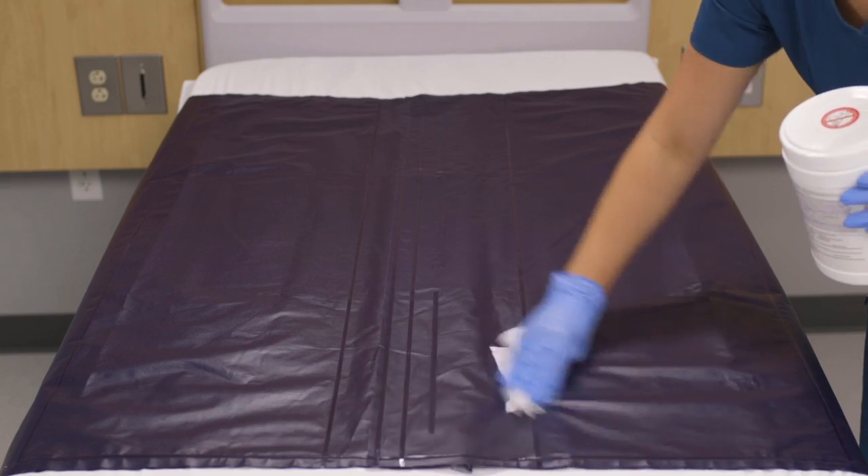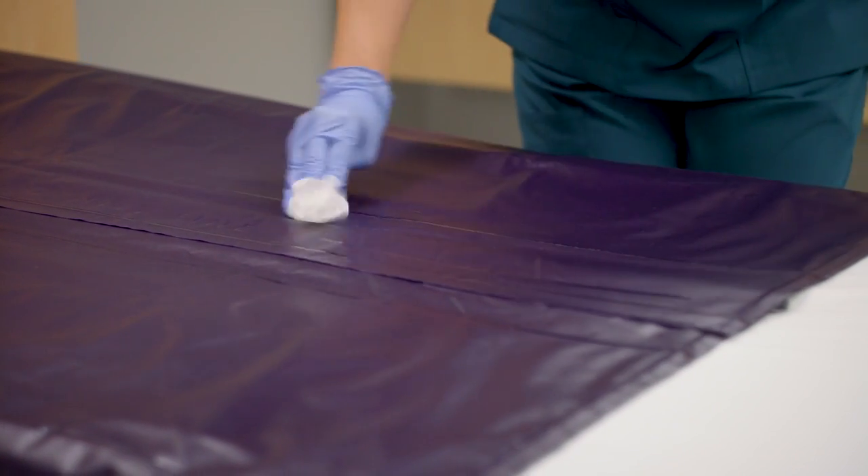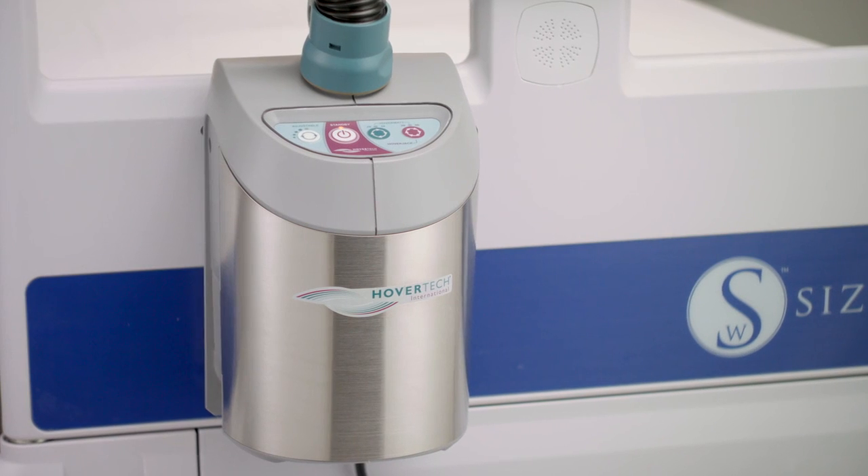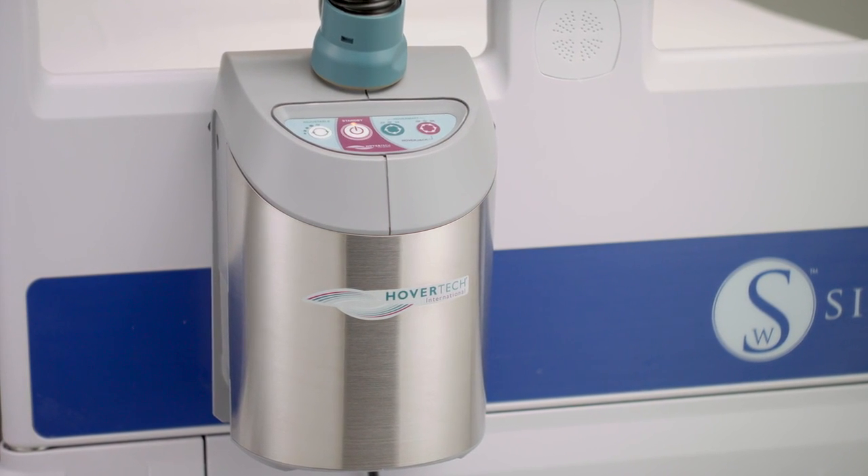If lightly soiled, wipe down the top surface with a facility approved disinfectant used to clean stretchers and mattresses. The Q2 Roller requires the HT-Air air supply with variable speed function for safe operation.